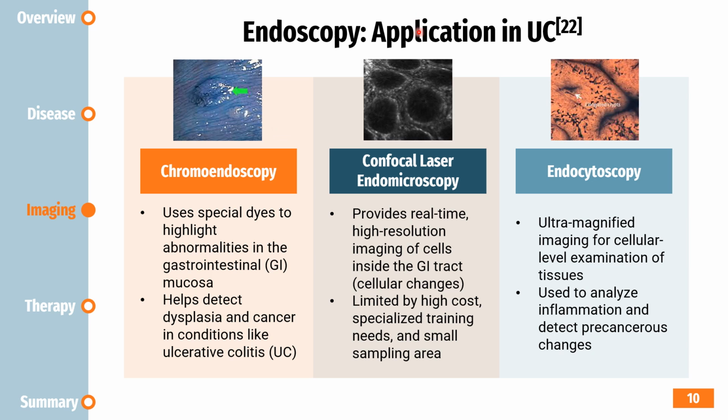Next is confocal laser endomicroscopy. This advanced tool allows doctors to see detailed, real-time images of cells inside the digestive tract, as you can see in the photo here, which would then help them detect changes at the cellular level. However, it is really expensive, requires specialized training to use, and can only examine a small area at a time, which then limits its widespread use.